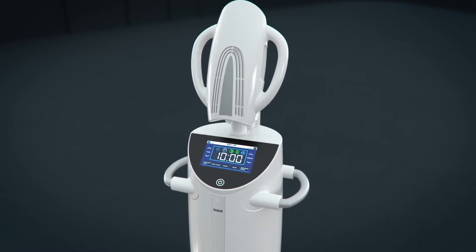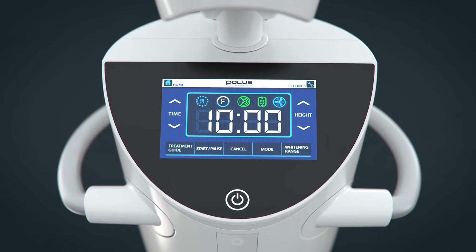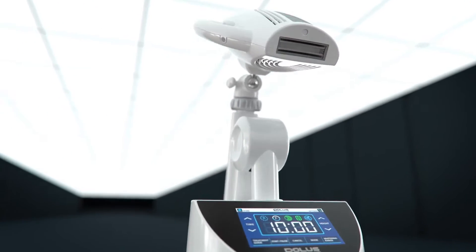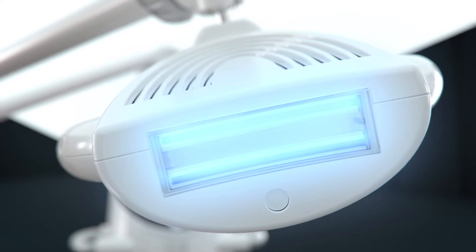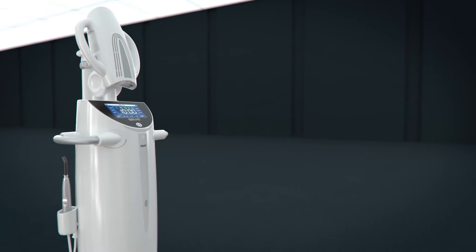The system also features a brand new intuitive touch screen with built-in instruction modes based on your client's needs. The improved motorized arm offers more precise adjustment. An upgraded fiber optic light filtration system blocks out all harmful heat and UV light. A built-in air ionizer provides a cleaner environment for the treatment.